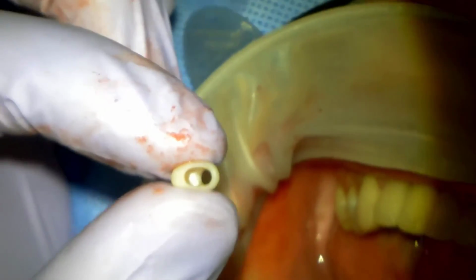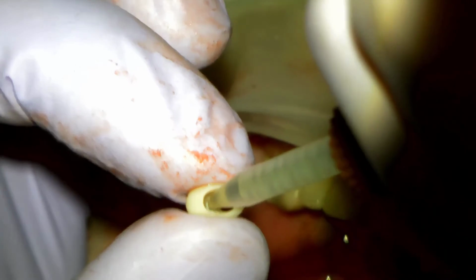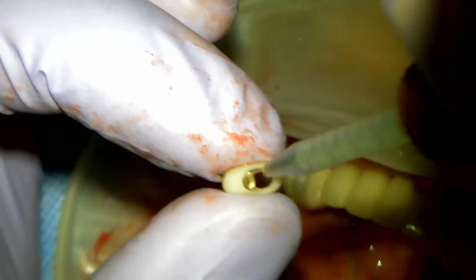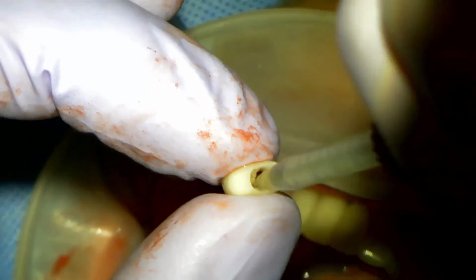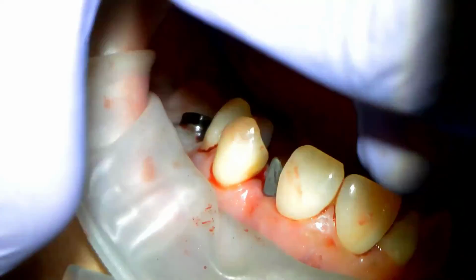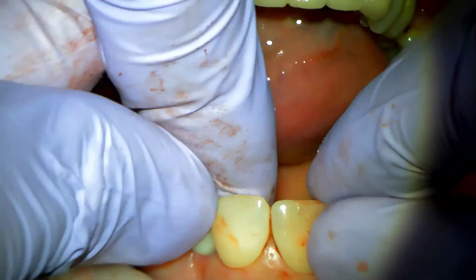Here's our temporary crown. I'm going to go ahead and put some temp bond clear in here. I'm a little bit liberal with this, knowing that a lot of it will just spill out of our screw access hole. But we will do a good job cleaning that up.